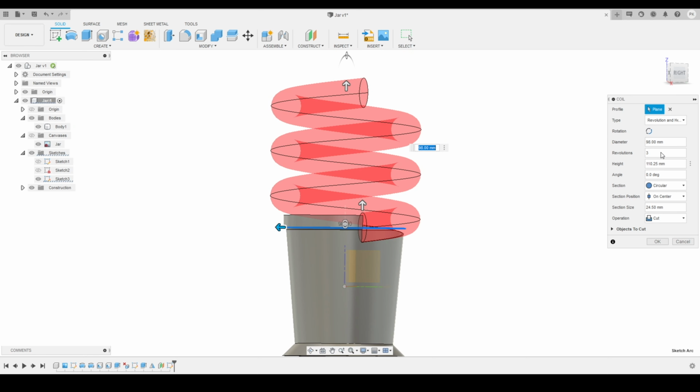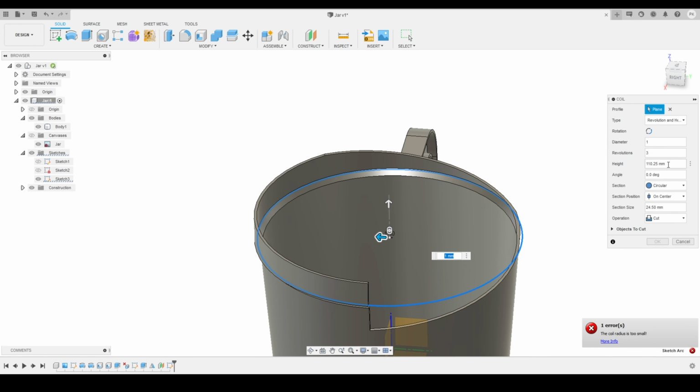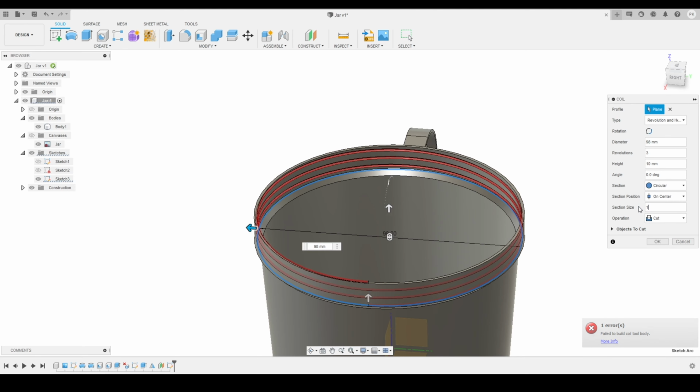So we'll go on to the over here, and I have to change the diameter of this thing, and then the height of the complete thing. So I just changed that to 10 millimeter. And this one I think we had to keep the main diameter, it's a major diameter, so I have to keep that one as original, and then I just have to adjust the section sizes.